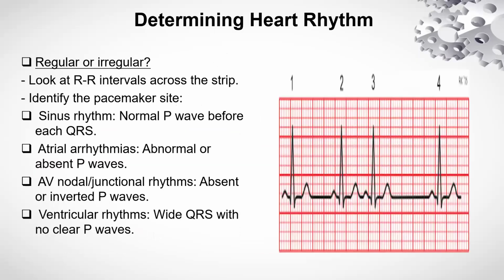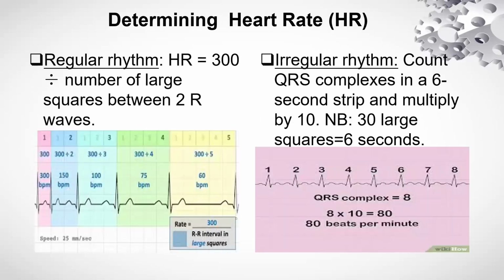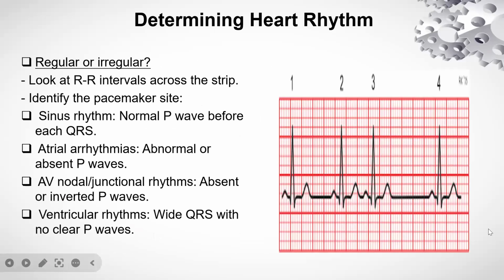if you read an irregular rhythm, I mentioned this before, look at it. Is this a normal reading? Anybody? Look at the RR intervals. Are they regular? Anybody? No. So this is an irregular rhythm, isn't it? Irregular, yes.